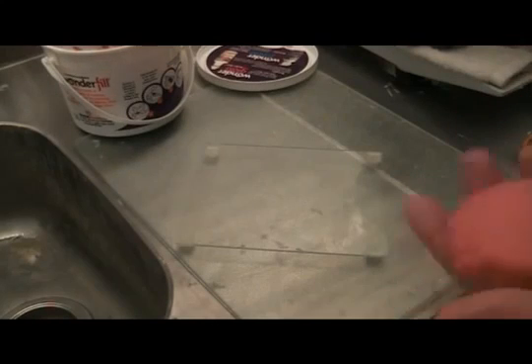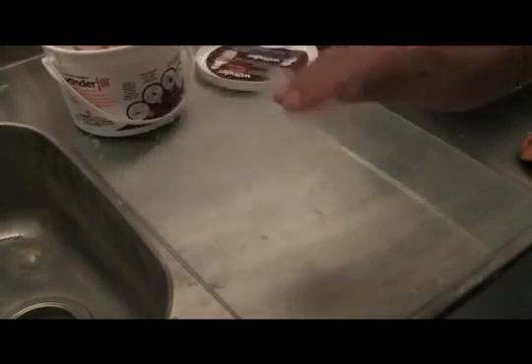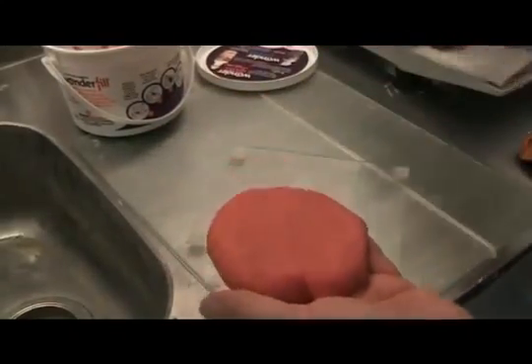Alright, so let's look at the procedure here for using Wonderfill and Wonderformer together to create what I call the Wonder Box system. Literally, we take our sheet of 5x5 plexiglass or styrene, whatever you want to use, with the feet on it, and we mold ourselves a patty of Wonderfill that we're going to place on that plexiglass.